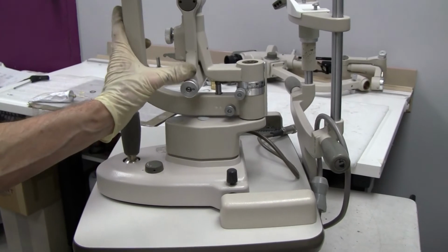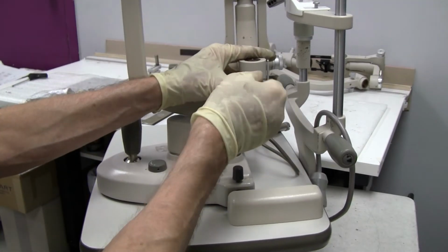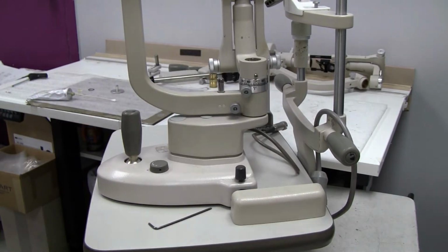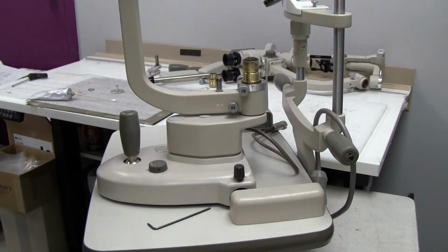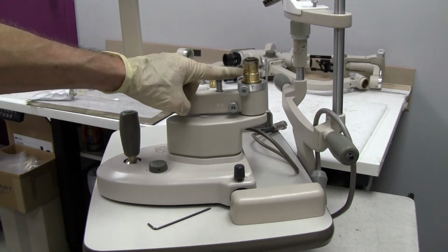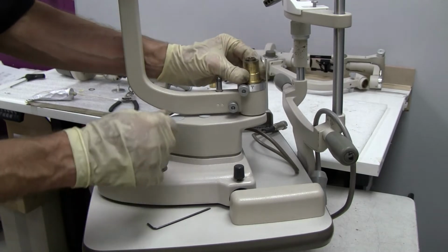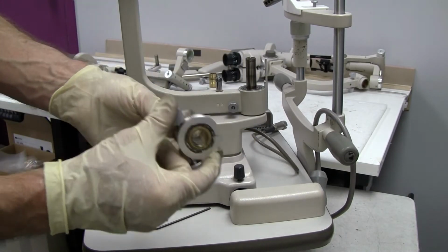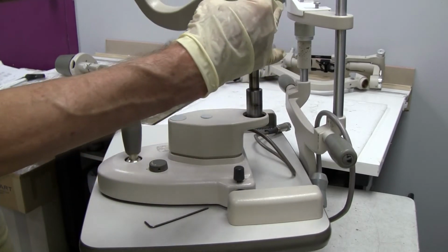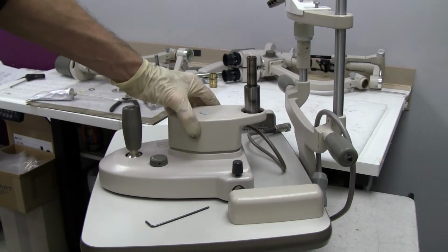The base, you need to take everything off. You need hex screw or Allen wrench, 2.5 millimeter. Then you will need snap ring pliers to take off this snap ring. Take your bushing off, take this off, you take your microscope arm off, that leaves you with the base.